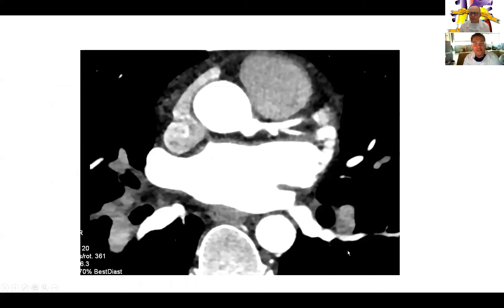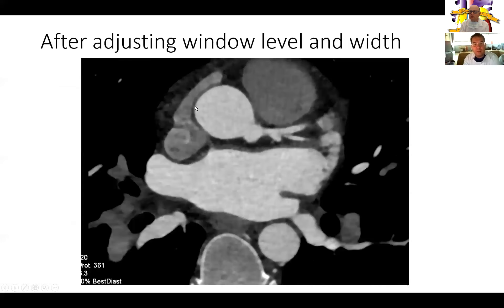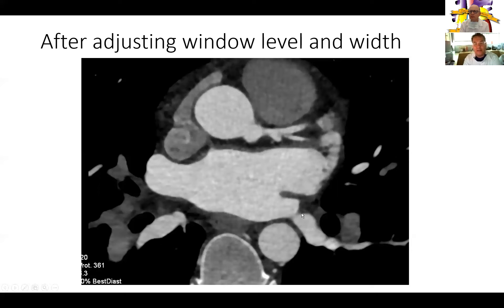Before you start analyzing, it's important to optimize the images. Sometimes the computer presents images that are very bright with no detail at all in the branches — in this case, the left main. But if you simply modify the windows and level of the imaging, it becomes a lot softer. You can see the walls of the vessels, and this is the recommended way to analyze these images: modify the level of contrast and the width and level of the window.